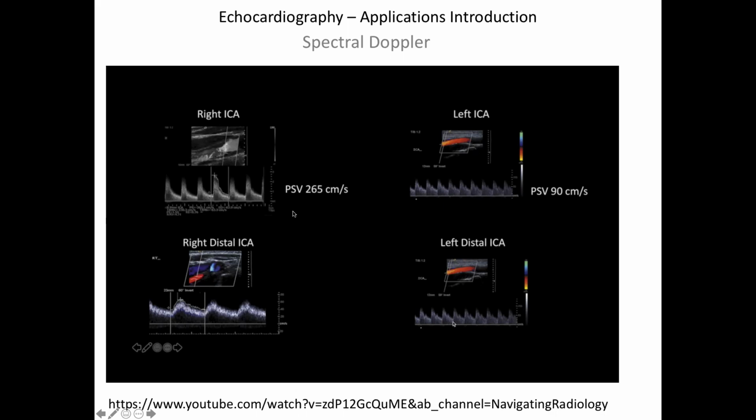So this comes from a whole explanation of the use of Doppler, or spectral Doppler, it's called. This is the brightness here, the intensity of the velocity. All right, so this is velocity on this axis, and the brightness of this line is essentially the spectral component. So how much of my signal is at this velocity versus this velocity, right? So you do that just by doing quick Fourier analysis over a window of that velocity signal, and you get a spectrum.